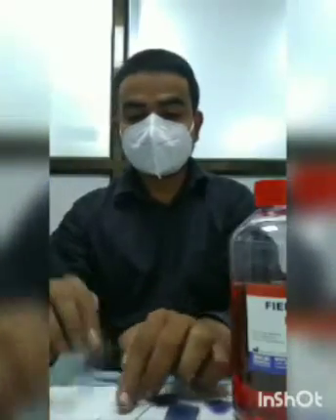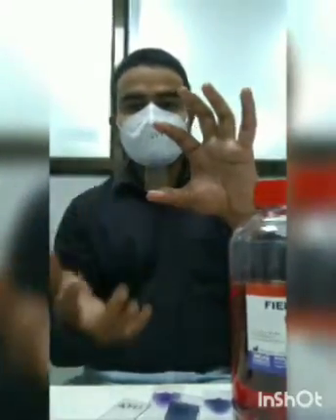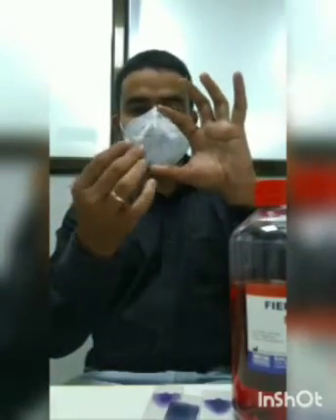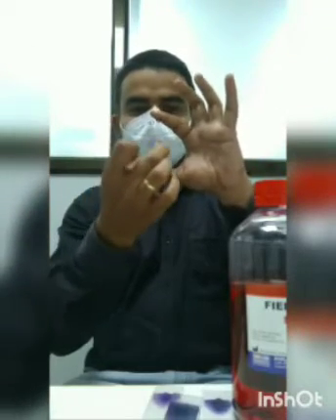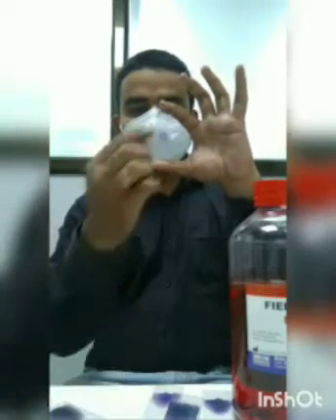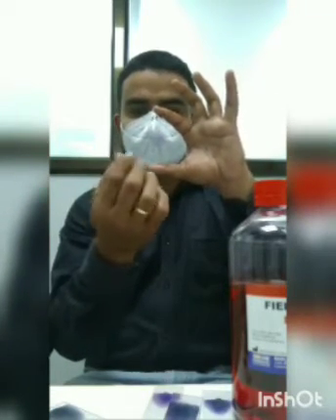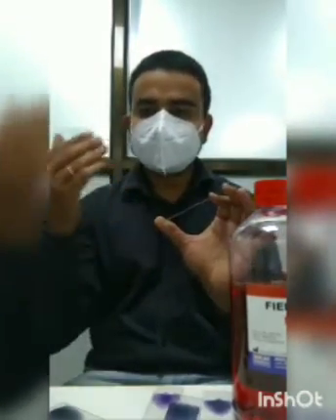Now here is an example of a thick smear. For a thick smear, we take a drop of blood and, using the corner of one slide, slowly rotate it in a circular motion to make a coin-shaped area of approximately 1 to 1.5 centimeters. Now let it air dry, and then we stain it.